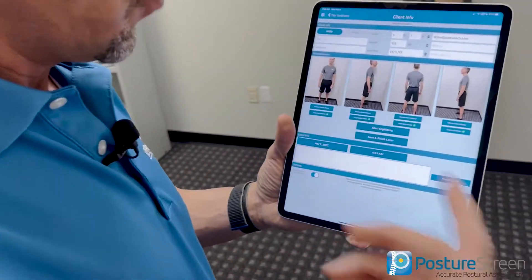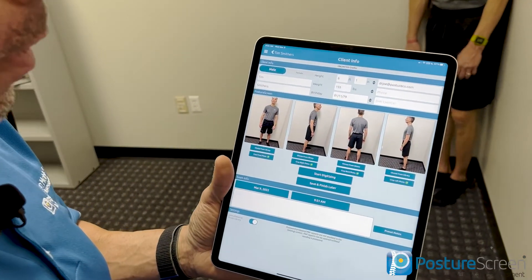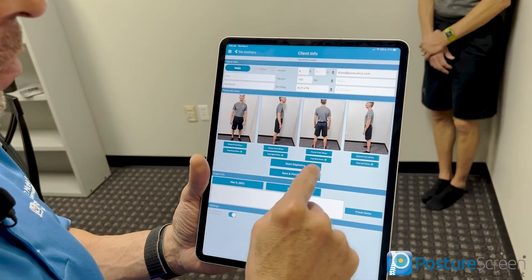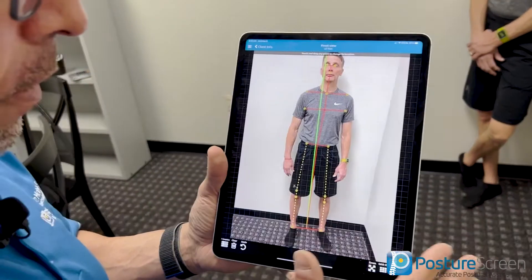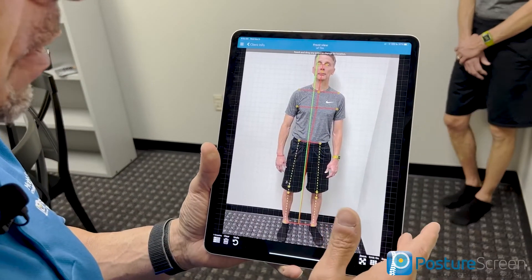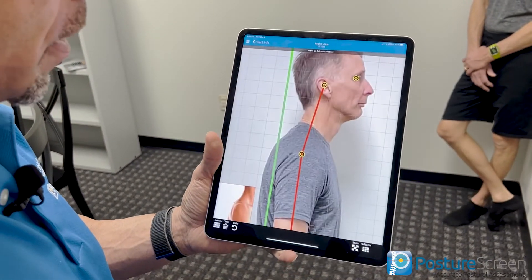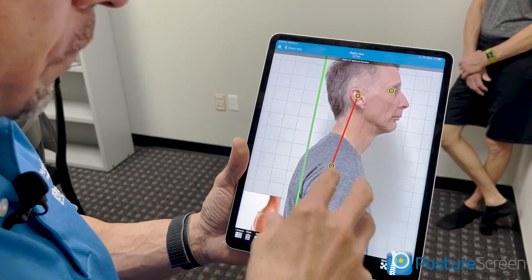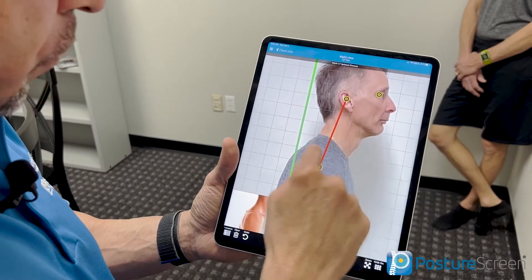At that point we're done capturing the photos. You don't have to do the assessment right now — you can hit Save and finish later. But we're going to hit Start Digitization. At this point you can correct points if needed; if I need to drag any points to the correct location, I can do that now.